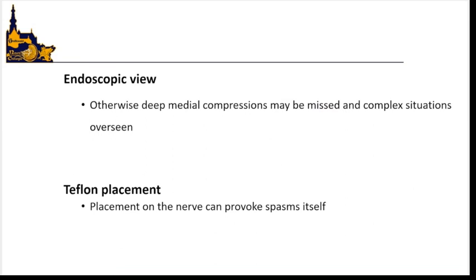Though microsurgical view alone provides perfect illumination and magnification, while still enabling the surgeon to operate two-handedly, especially deep and medial compression locations at the pontomedullary sulcus or hiding behind the lower cranial nerve group are difficult to visualize, but are easily seen when using a 45-degree endoscope.